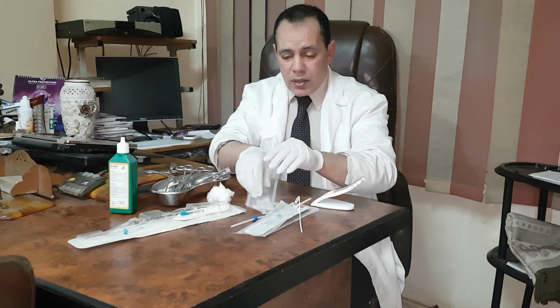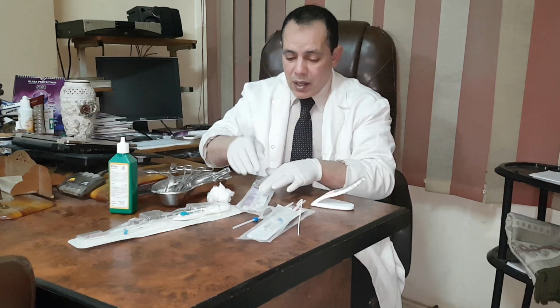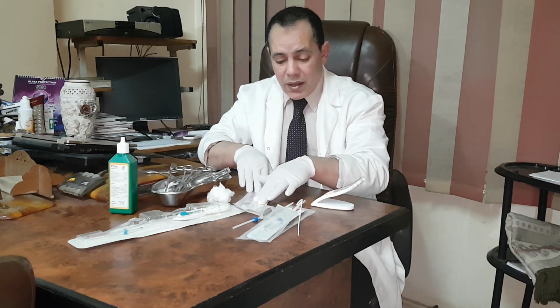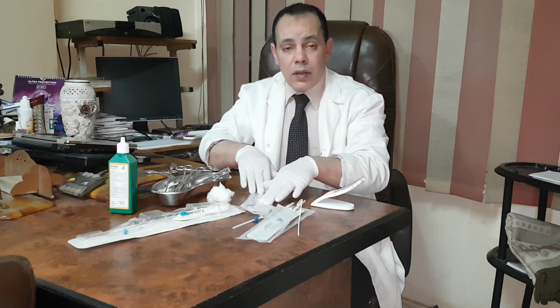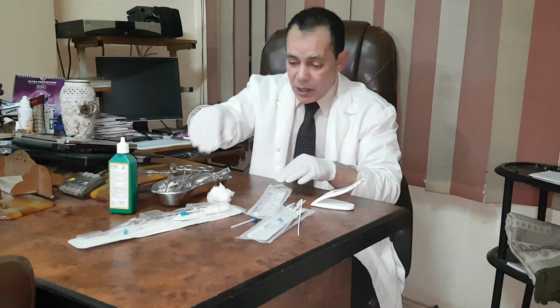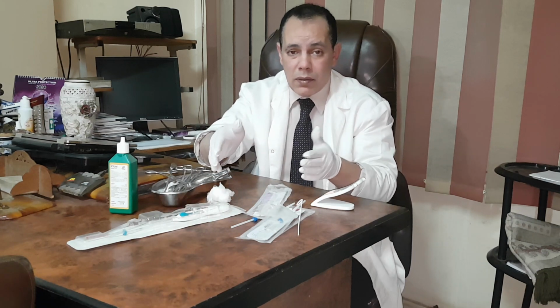So, the first copper T is inserted by the withdrawal technique. The second, the copper serrated IUD, is inserted by the pushing technique only. Okay? So there is no plunger because I don't need a plunger.